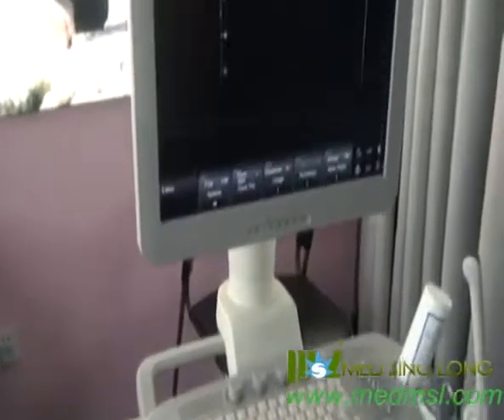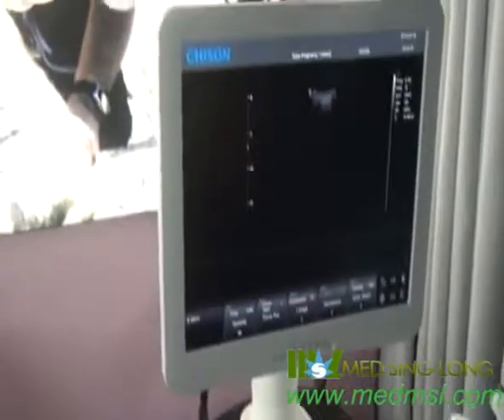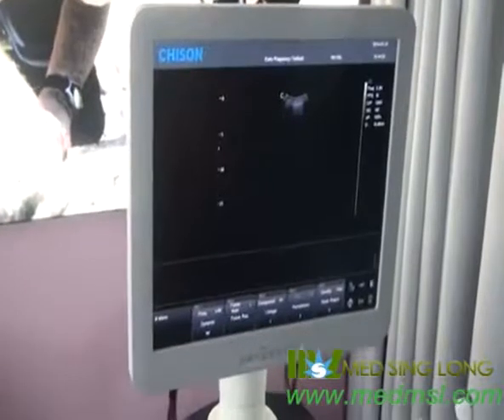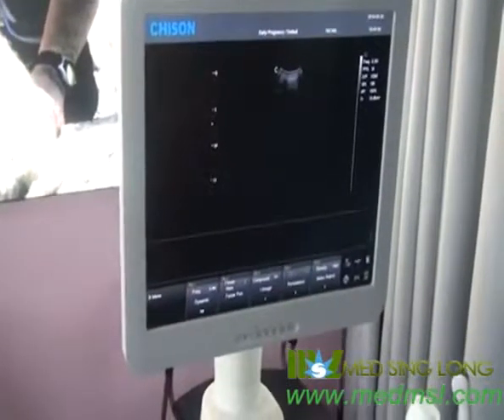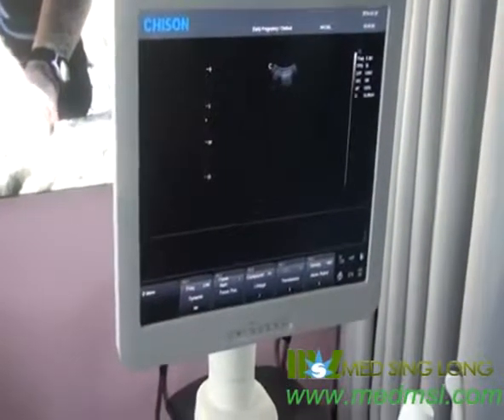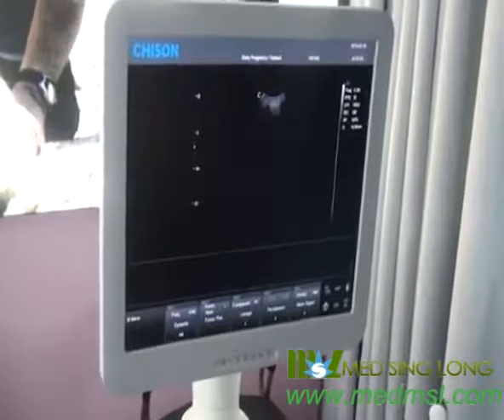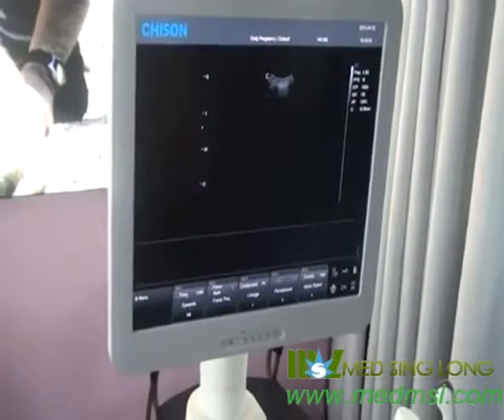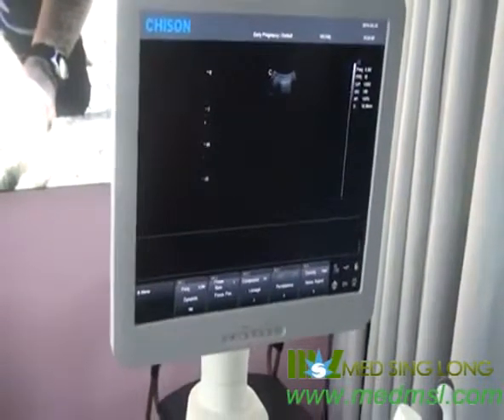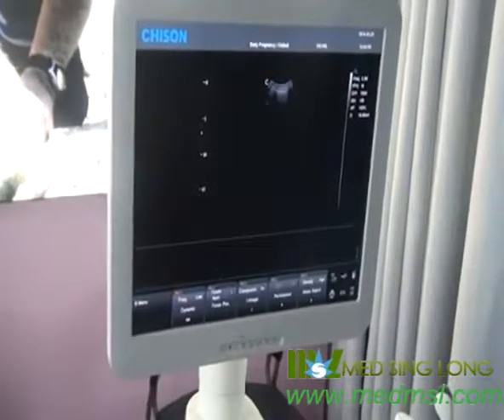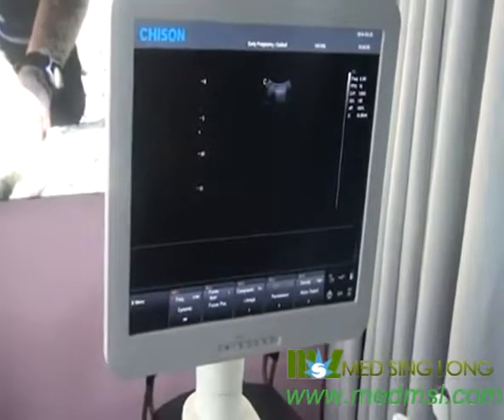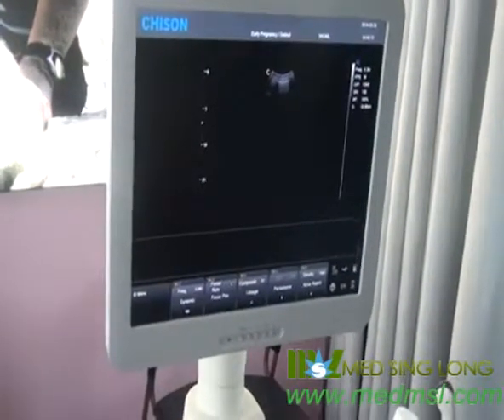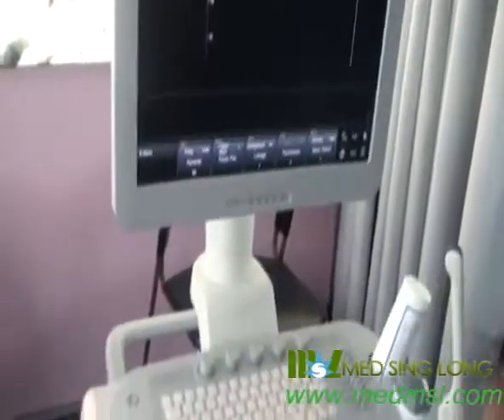Hello, thank you for choosing Chison. It's my pleasure to introduce the operation of I3. First, I will mainly introduce the parameters in different modes. Second, I will introduce the system setting. Third, I will take the 4D probe as an example to introduce the operation.